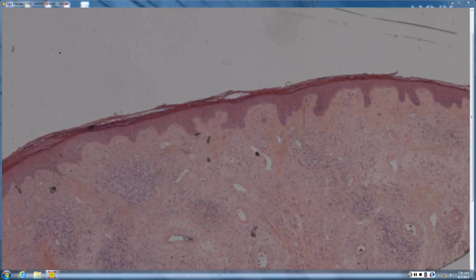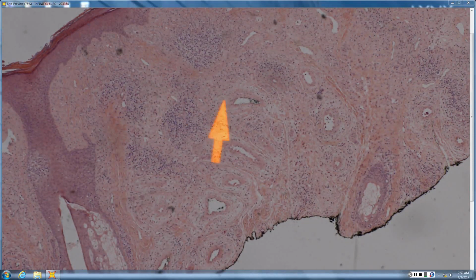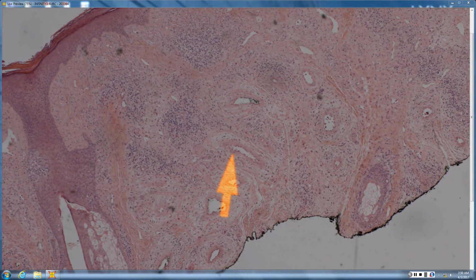What else we got here? Kind of busy dermis, some larger vessels maybe down deep, and smaller vessels superficially. So you've got larger vessels, and tell me about the endothelium jutting into that vascular space. Yeah, kind of like a hobnail-like pattern. So you have a central thick-walled vessel with a hobnail, just like that little feeder vessel you see in the middle of a pyogenic granuloma. But instead of growing a PG from the little AVM, this thing has lymphoid aggregates, and then what are those bright red things scattered in with the lymphs?